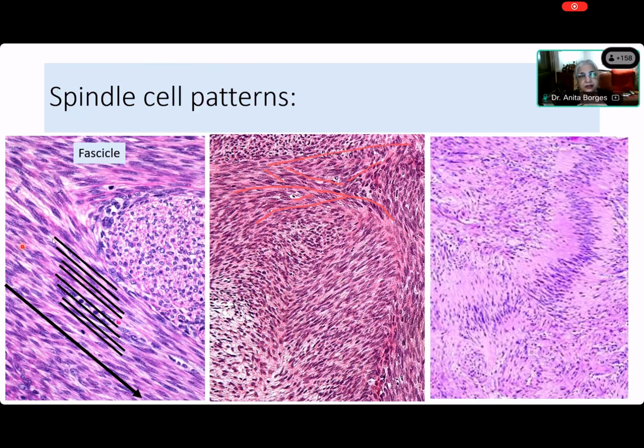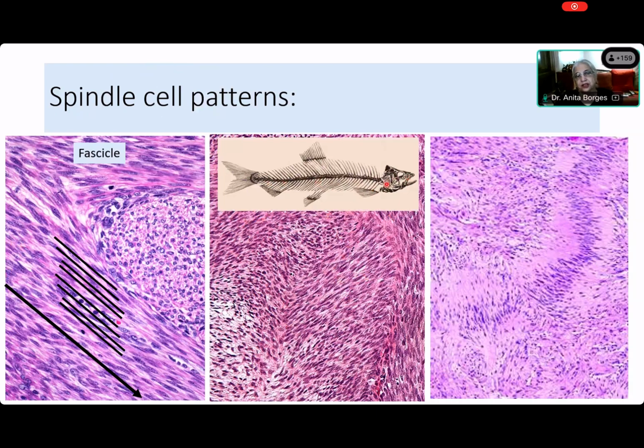Okay. Here. The herringbone is here. You see it. Yeah. That is the herringbone. I mean, you can take any other fish which has what? It's got a spine, and it has got bones that are deflected away from the spine, but not at right angles. They are deflected away in an angular fashion.